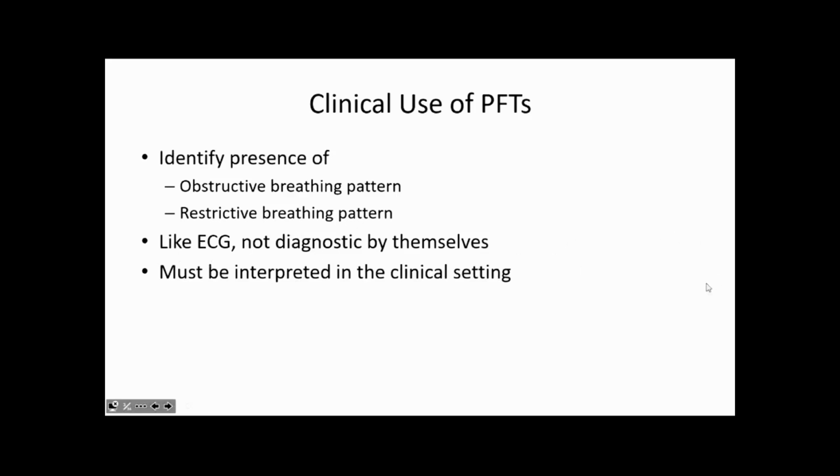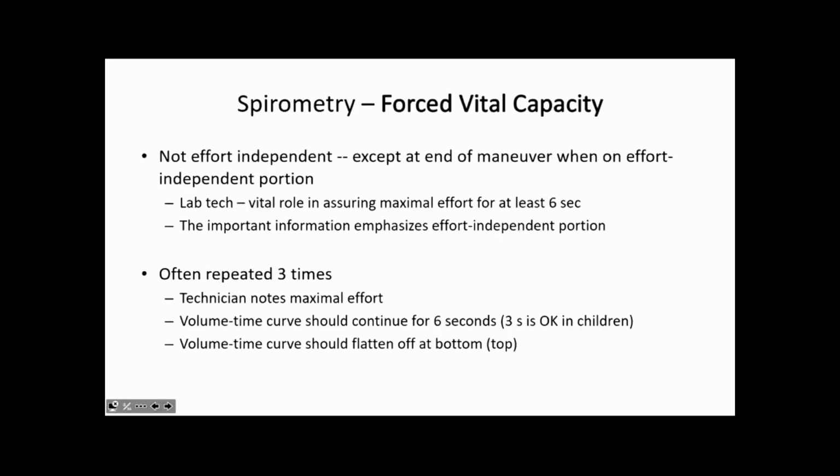So like ECGs, pulmonary function tests are not diagnostic in and of themselves. They're just part of understanding the whole clinical picture of your patient, and they really have to be interpreted in the context of the clinical setting of your patient, history, physical exam, and so forth.